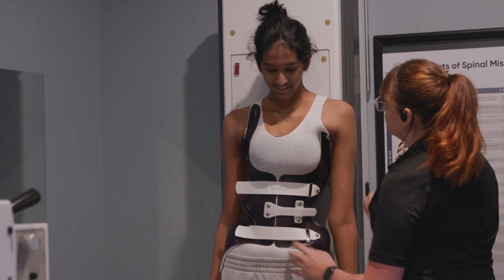By using the most advanced digital X-ray technology with the highest accuracy and least radiation exposure, these X-rays can provide a very detailed picture of what's occurring in the spine and give us a biomechanical analysis of the scoliosis. This biomechanical analysis measures more than just a Cobb angle — it measures flexibility and motion, segmental integrity, and alignment to gravitational forces. So we're looking at many different factors, not just Cobb angles, to help determine the most effective way of treating this person's scoliosis.